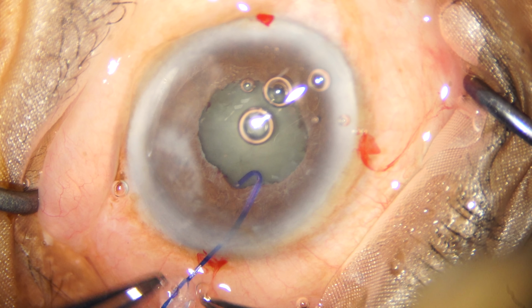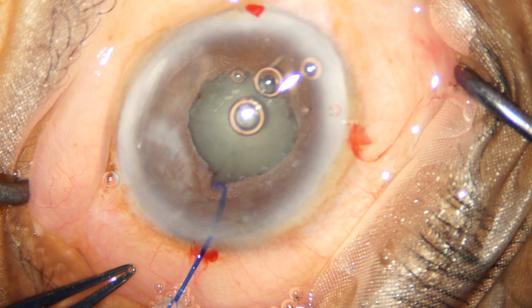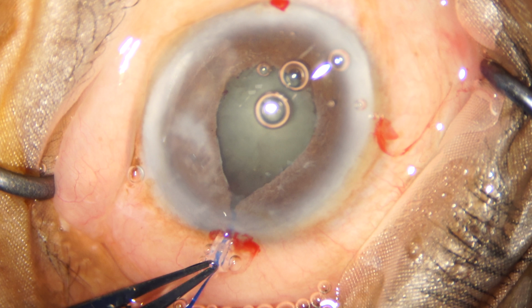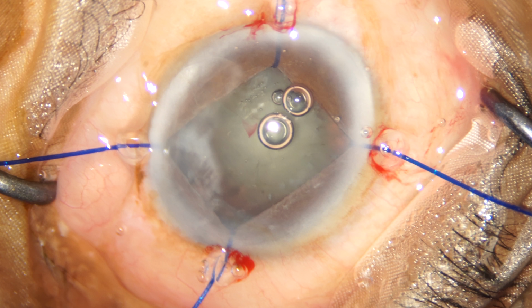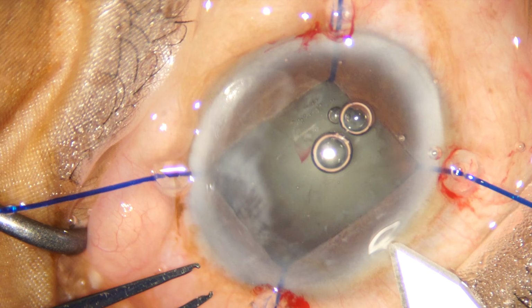So once the hook has been rotated in an adequate manner in which it engages the pupil margin, I am pushing the rubber stopper towards the limbus to lock the hook in place and to achieve a stretching in that zone. We repeat that for all four hooks. So we've now achieved a large square sized opening which is adequate for the phaco emulsification process.